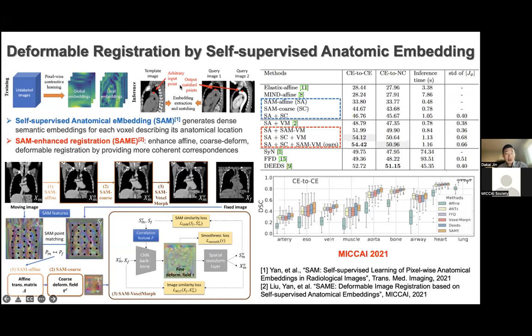So this actually provides some very useful information for the registration process, because registration often uses local image or similarity features to align these images. However, for image registration, the semantic information is important, and it is not easy to calculate in either conventional or nowadays deep learning approaches.